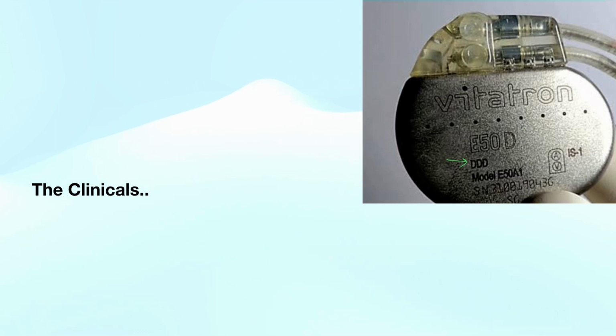Today we'll be discussing the pacemaker codes, the various coding systems commonly used in permanent pacemakers which are relevant to clinicians. What you are seeing in this image, as you can see at the green arrow, is DDD written on the device.